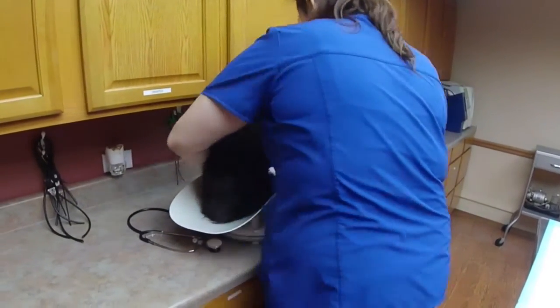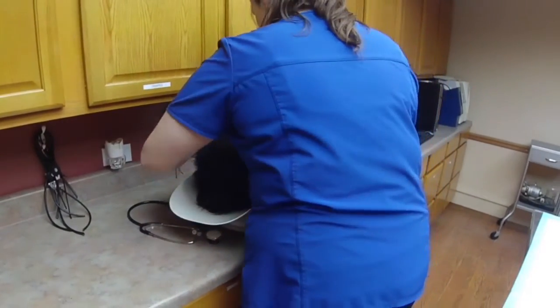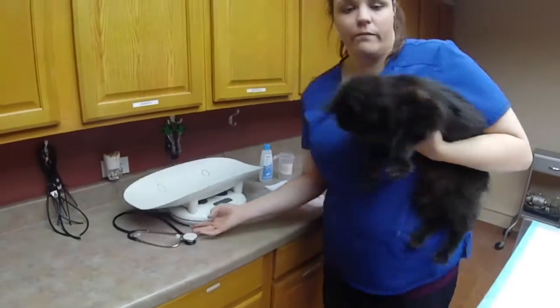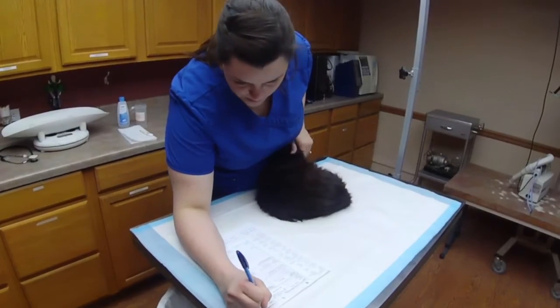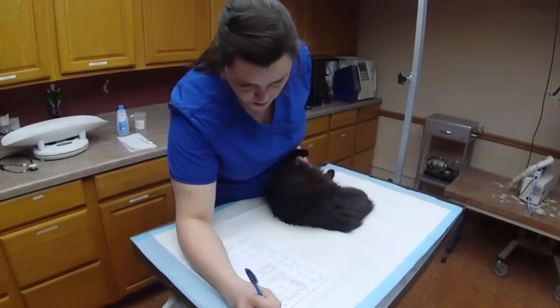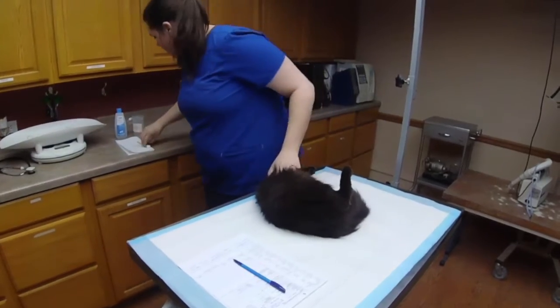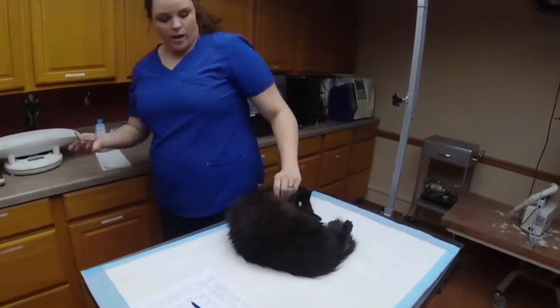You see here, she is 7 pounds, 3 ounces. We will write that on her physical form here. 7 pounds, 3 ounces. She eats Hill's Science Diet dry. We're going to get a temperature on her.